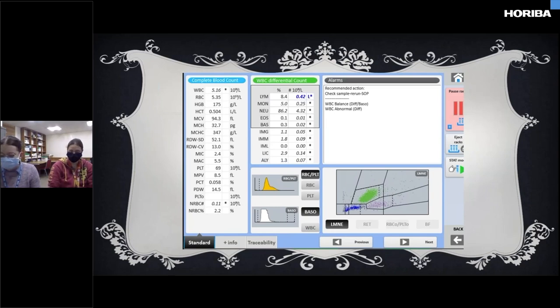So we made a film, because at North Devon we have to make a film when our platelets go below 100 for unexpected reasons. And then I phoned A&E and said that the coag wasn't going to be run. Although our coag analyzers can run samples with some hemolysis, the fact that the sample looked like it hadn't been spun at all was too much hemolysis. So we made the film and stained it. And the next slide is what greeted me at 1 in the morning when I looked at the film.